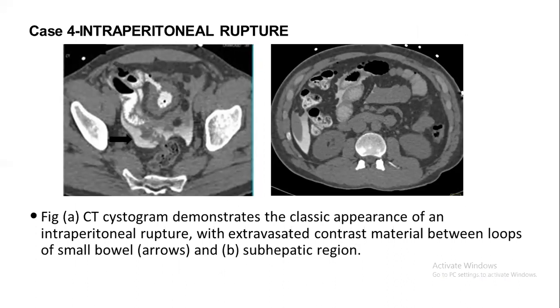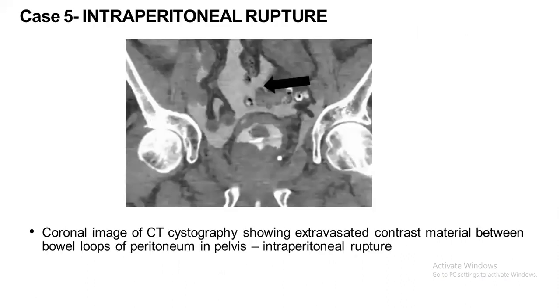Case 4: CT cystograms demonstrate the classical appearance of intraperitoneal rupture, which is extravasated contrast material between the bowel loops and in the subhepatic region, as shown by the arrows. Case 5: the coronal image of CT cystography showing extravasated contrast material between bowel loops and peritoneum in the pelvis, consistent with intraperitoneal rupture.